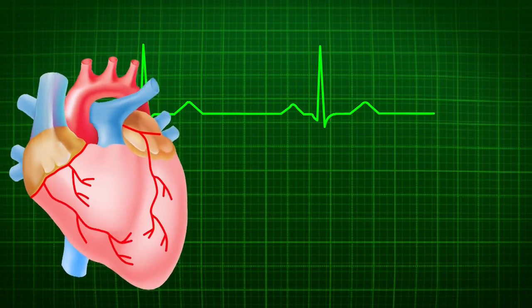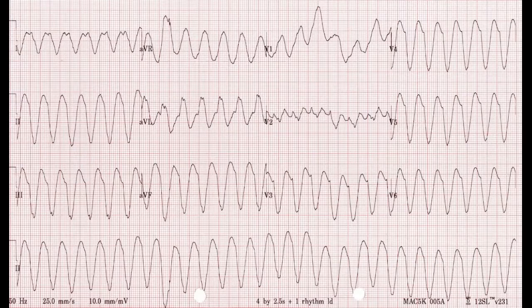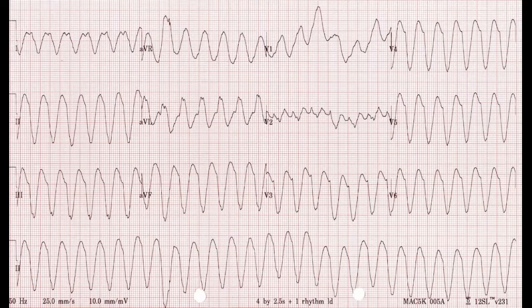If this discordance is absent in V1 to V6, that is the concordance — and that is bad. So if you see a wide QRS complex in the ECG and you think this could be a VT, carefully look at V1 to V6. If you find those QRS complexes are either all positive (R wave) or all negative (QS wave), that is possibly a VT according to Brugada criteria. If concordance is absent, then you go to the next stage.